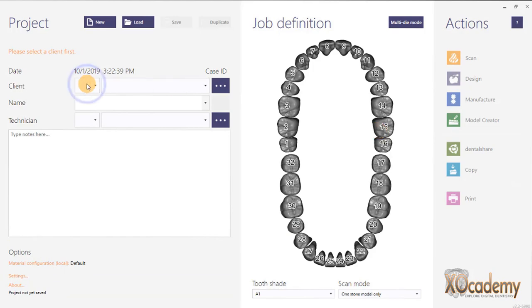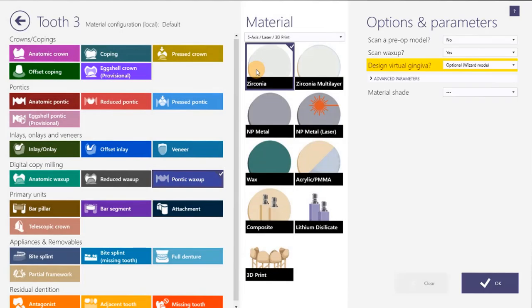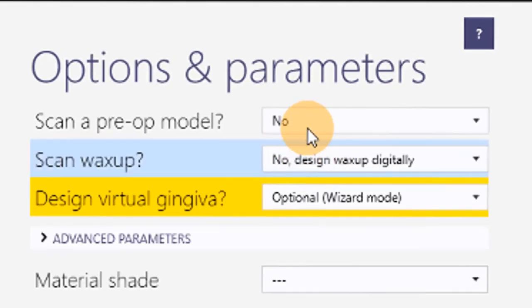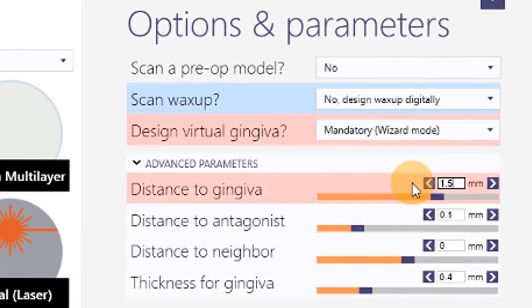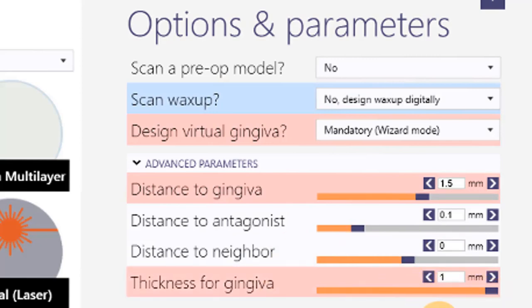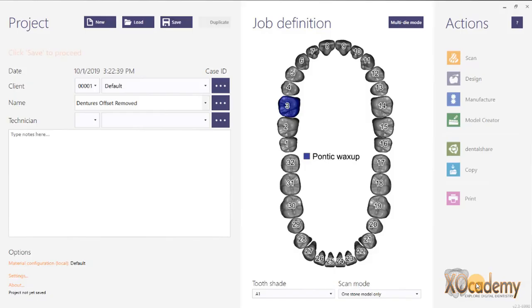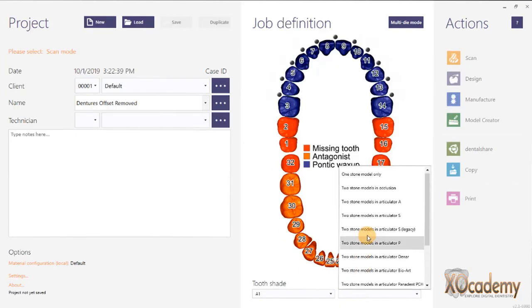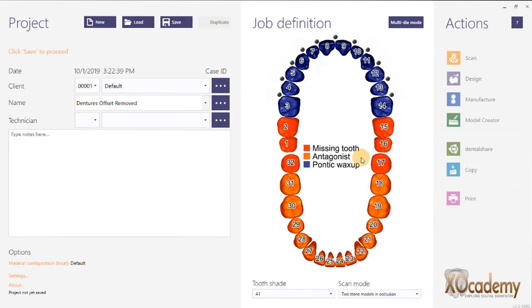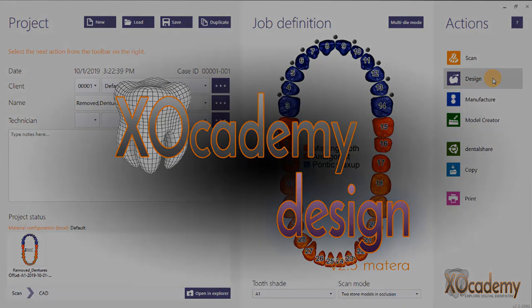In the beginning of this course I talked about how you define your job when you first open XOcad. For this case we designed it as Pontic and we didn't scan any wax up. We also review the other settings like distance to gingiva, distance to antagonist, distance to neighbors, and the thickness for your gingiva and how that's going to affect our final printed denture design. I also gave some tips and hotkeys on how you can quickly define a job, defining all of the teeth in an arch really quickly, so it should only take you a minute or two.